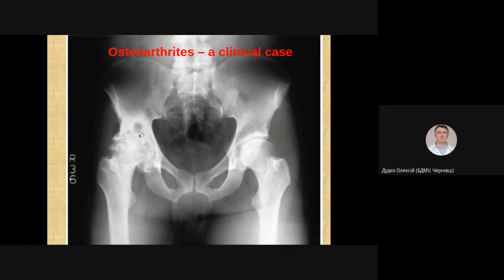Another thing we can note here are some translucent areas which correspond to cyst formation. There is a large cyst in the acetabulum and some small cysts in the femoral head, formed due to resorption of bone tissue.